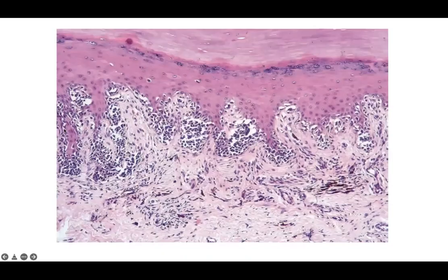This is a really nice example to show you the contiguous growth of atypical melanocytes along the dermal epidermal junction, not only at the base of the rete ridges, but even at the peak here above the dermal papilla. So this is where you get that lentiginous term because of the broad end-to-end, up and down growth pattern along the dermal epidermal junction. You can see some areas of pagetoid as well. Not super extensive pagetoid upward migration here.